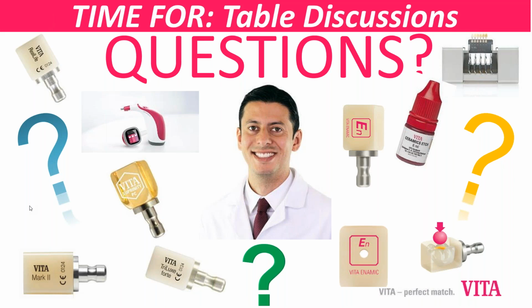And when we're doing full coverage and we have the space, I want to work the occlusion on that bisacryl and scan it and make sure that we can copy that for the final restoration. So we have less work to do, both on the clinical and lab side, to get that occlusion as ideal as possible. But a halfway mock-up doesn't really help. I think that a really well finished mock-up has a lot of value, but maybe working more on the matrix is something that is very helpful for clinicians, to get a better, cleaner result on the mock-up.